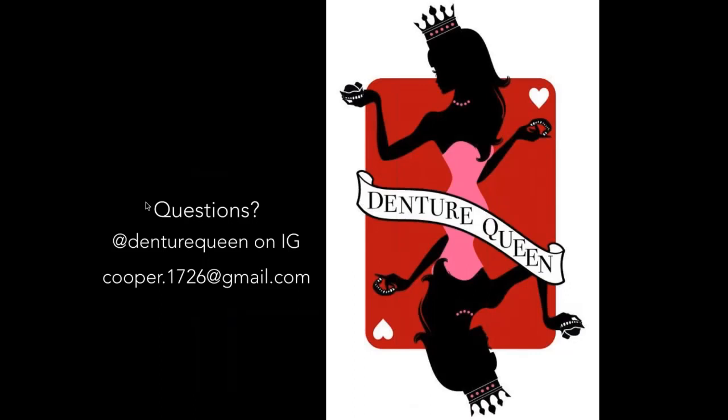And lastly, what does digital dentures mean for me? Instead of it being a better way to make dentures, I see it as just a better tool so that I can communicate with my patients when they are sitting there at their try-in and they tell me that they would like their teeth a little bit smaller. Instead of in my head saying, oh no, I have to order new teeth and reset these and oh my gosh, I'm gonna have to pay for another cart of teeth, I think, yes, of course, let me make these a little smaller for you.